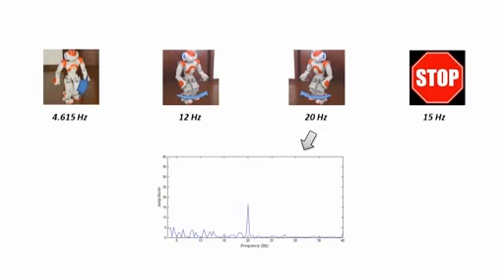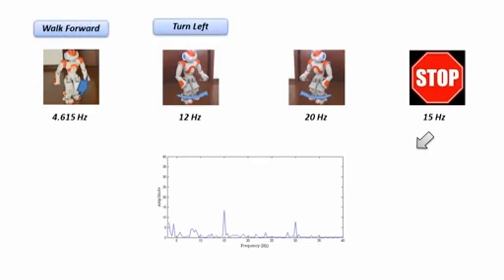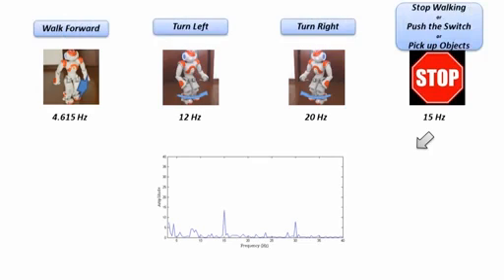The results show the normalized power spectral density of brain signals generated while staring at the stimuli, flickering at different frequencies. Our system translates these brainwave patterns into commands to control 4 robot behaviors. Using this approach, the subject is capable of interacting with the humanoid robot via brain signals.